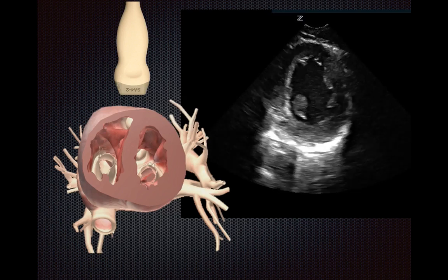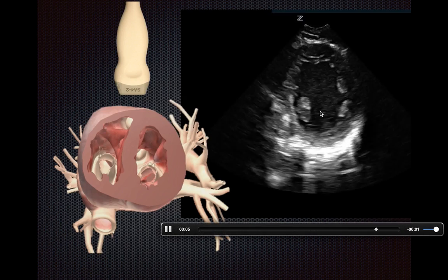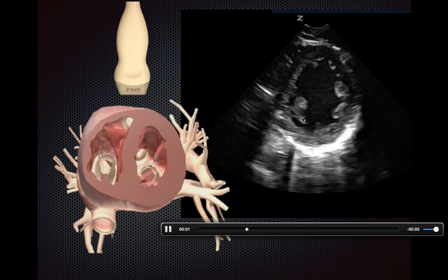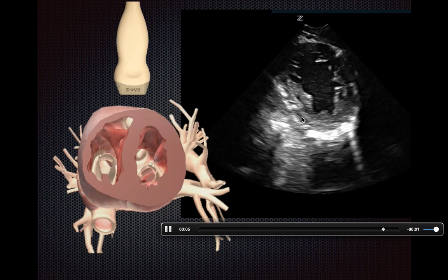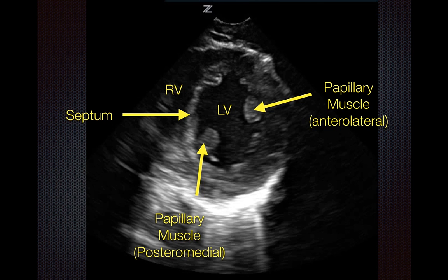The papillary muscles should show up, and this is really the view we're trying to obtain in the parasternal short axis. The anatomy is as follows: the left ventricle is on the right-hand side of the screen, the right ventricle is on the left-hand side, with the septum in between. Ideally the ventricle in the absence of pathology should look fairly round and concentric, and then you have your anterolateral papillary muscle and your posteromedial papillary muscle.